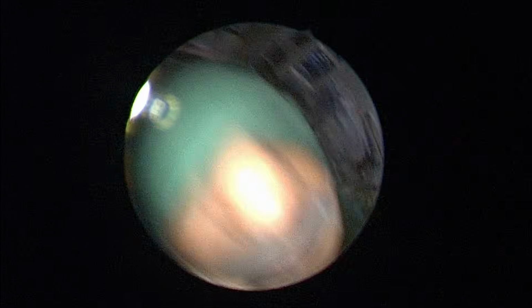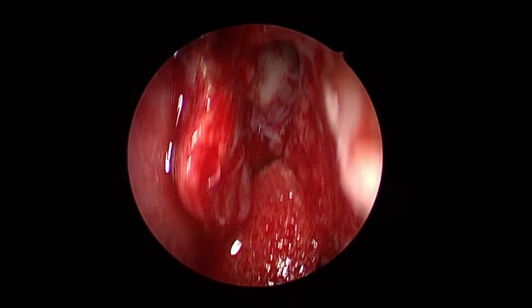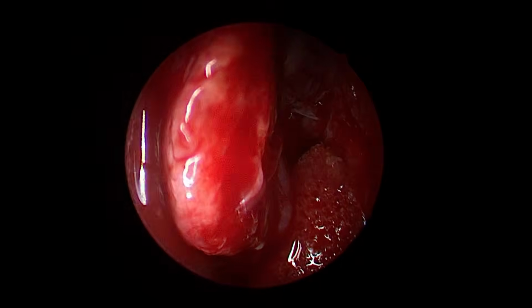Yes, sir. Changing to 0 degree. See, follow the beak, you are in the frontal. Forget about all that, this cell, this much. There are thousands of people there to confuse you. This is the God-given most stable landmark.